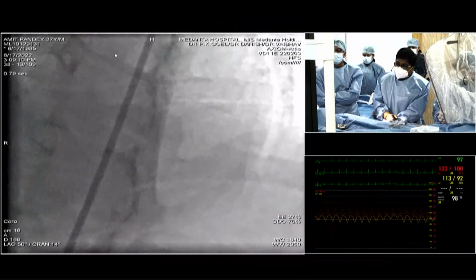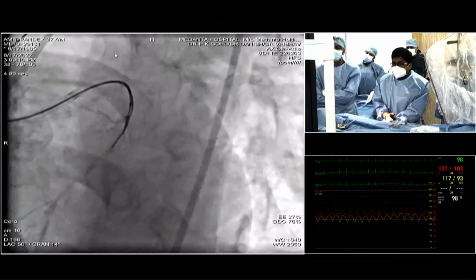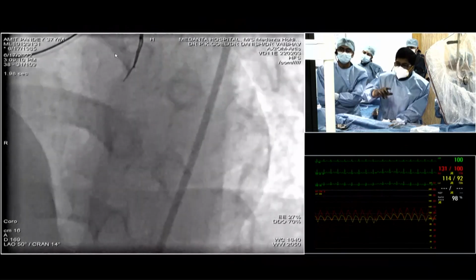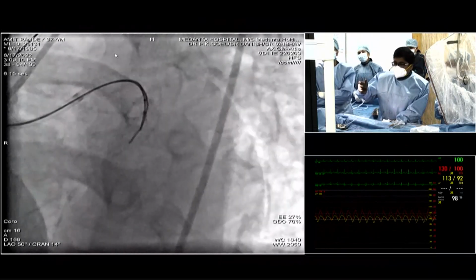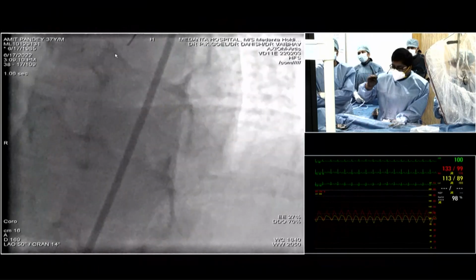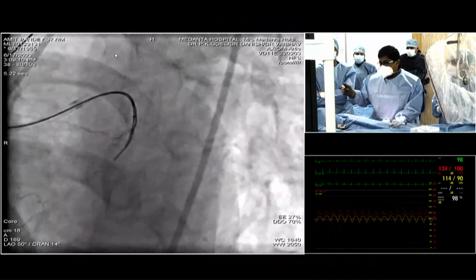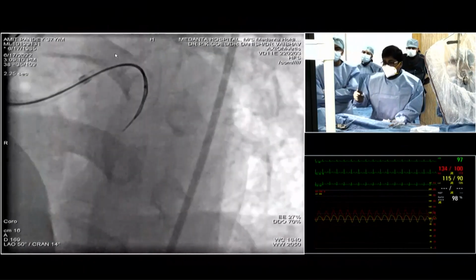The 3D wiring that I keep talking about is nothing more than a concept to handle wires. I use that also in between, trying to see where exactly I am in space and how to get back. Otherwise, you use your wits, especially if you are using single plane. If you're biplane, you are much better.